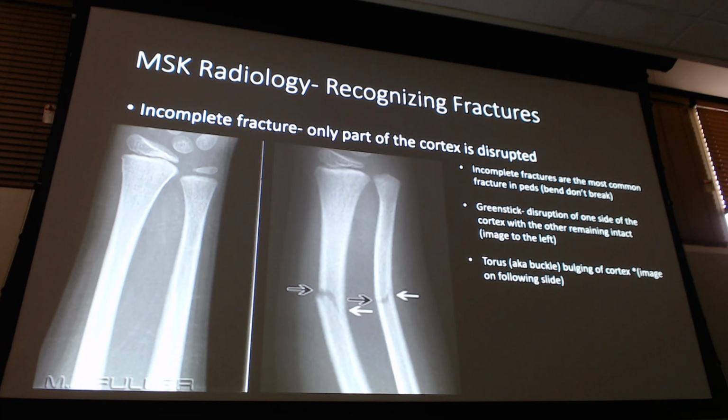Nightstick fracture. The difference in adults and kids is two things. One, growth plates. Two, bendy versus not bendy. The adult bone will still be straight. It won't be bent because it just took the impact, right? And didn't fracture all the way through. This, the kid likely fell, went bendy, fractured part of that, and that's not all the way through. So green stick fracture in kids.